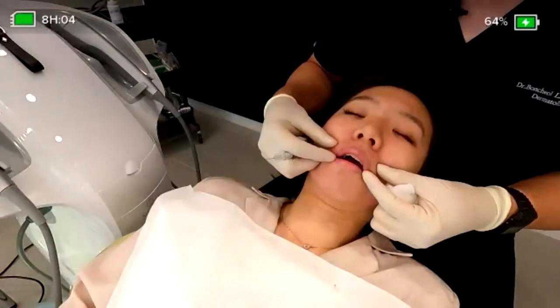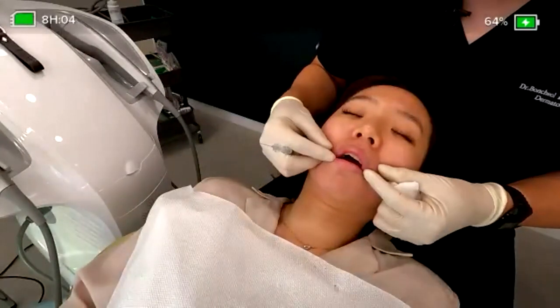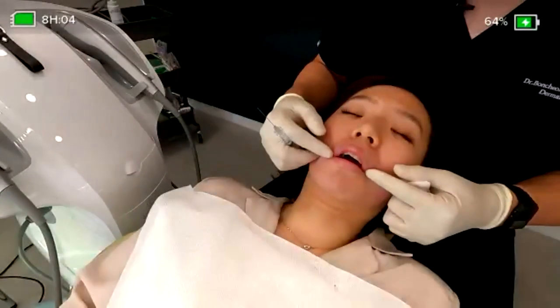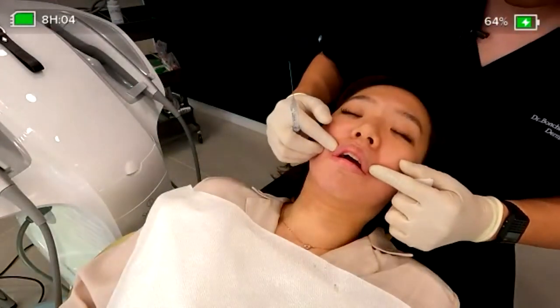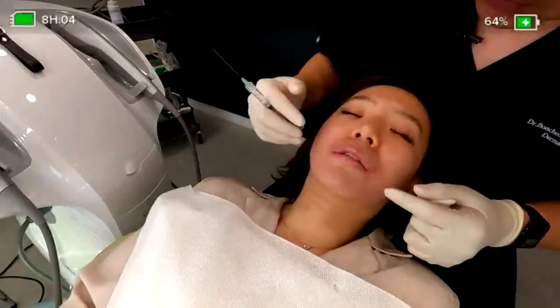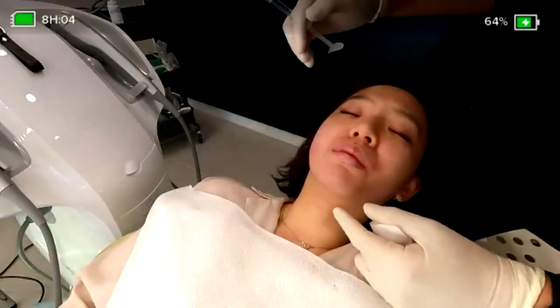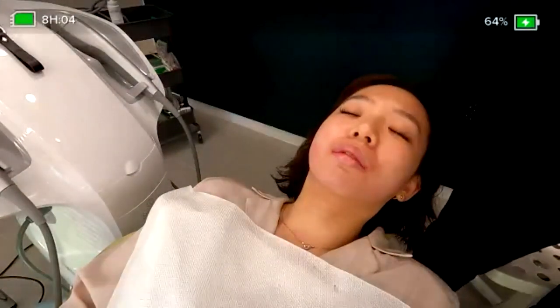I can only feel it if she is opening her mouth, but usually if it is anchored here in the angular lips, the downward is not good. So only here on this inverted part. 자, 이 사람 닫아볼게요. 아주 좋아요. 카메라 한번 클로즈업해서 위에서 한번 이렇게 찍어보시죠.